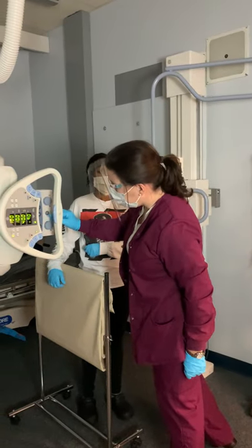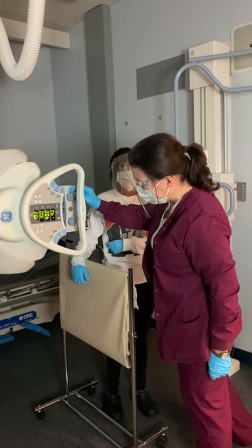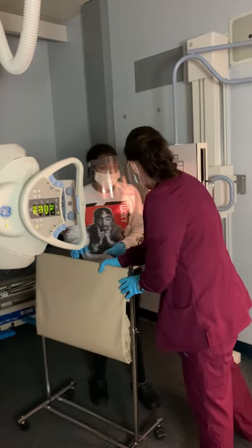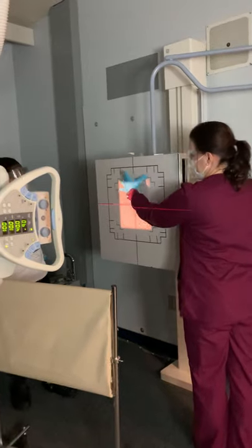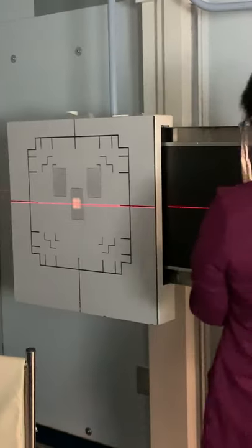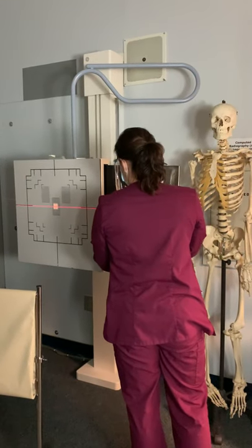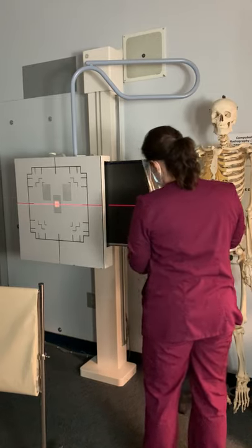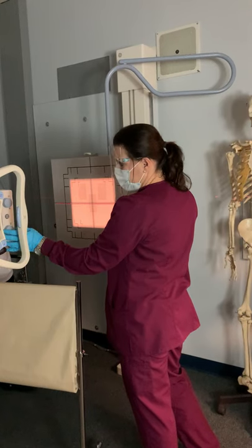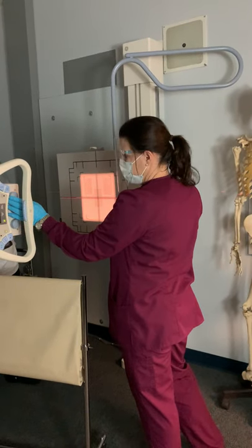For this, we're keeping our collimation open to 10 by 12, but this 10 by 12 is going to be lengthwise. So 10 by 12 lengthwise means the 12 is your length — it's longer. You need to take your IR and turn it lengthwise. The reason we're doing 10 by 12 lengthwise is because we're going to include the scapula coming in to 10 inches.